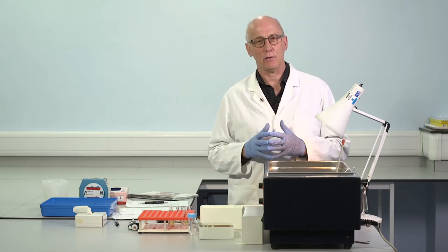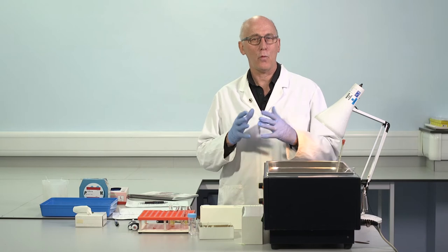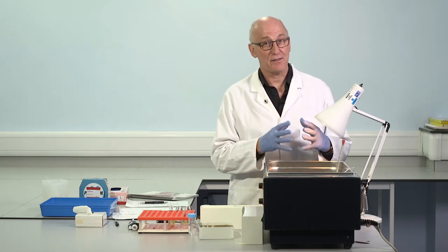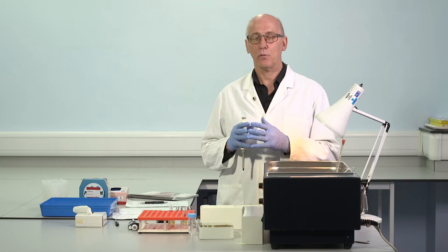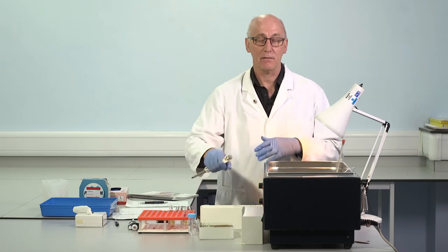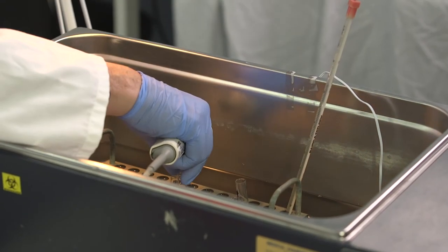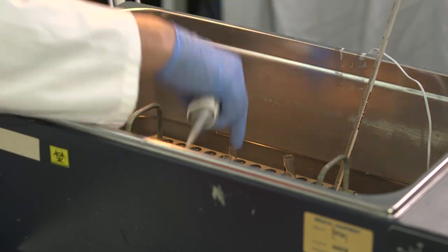So if we make a mixture, an equal volume of patient sample with pooled normal plasma, each contributing half to that mixture. If the patient is missing, is deficient in one of the clotting factors, it will be provided in the pooled normal plasma. Pooled normal plasma has approximately somewhere around 100 international units per deciliter. Some people would say 100%, but I would strongly prefer international units per deciliter. Normal plasma contains close to, usually, 100 international units per deciliter. Factor 8, factor 9, all the clotting factors.